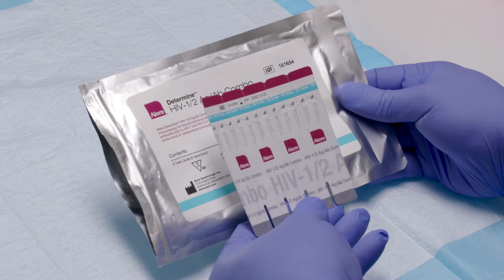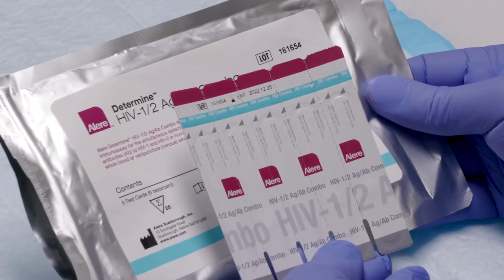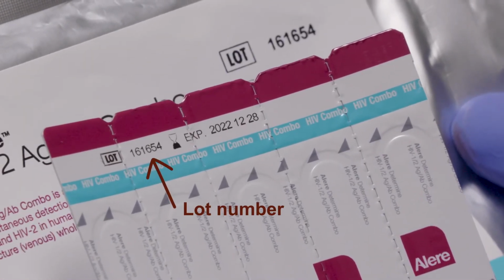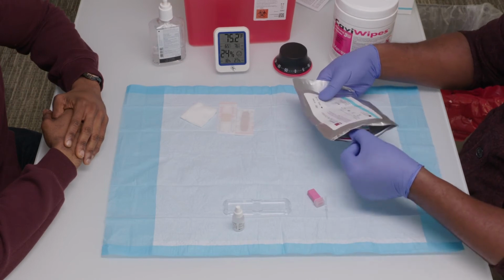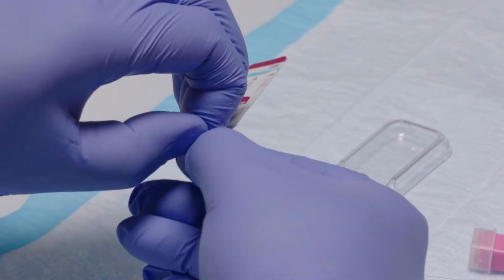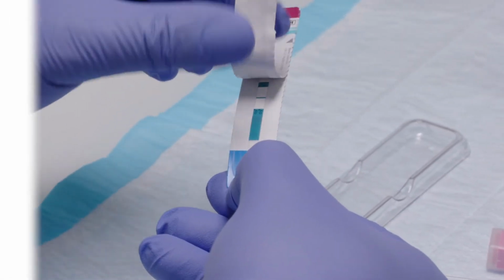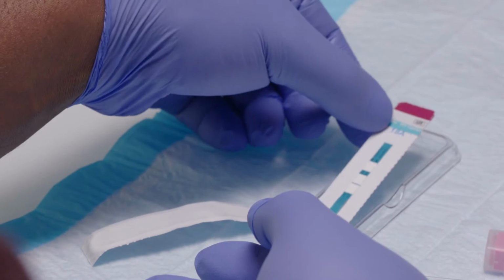Carefully tear off a test strip from the right side of the card so that the lot number printed on the leftmost strip remains intact. Return the rest of the test strips to the pouch and close the pouch using the Ziploc. Remove the covering of the test strip and place the strip flat inside one of the disposable workstations. Avoid touching the sample pad on the test strip. Once you've prepared your workstation, you can collect the sample.